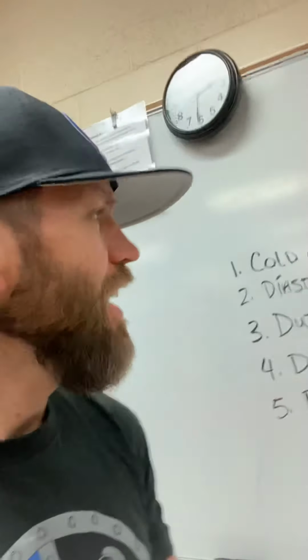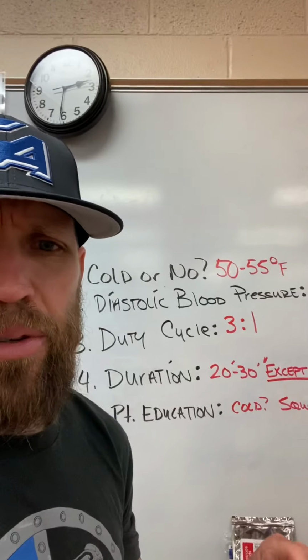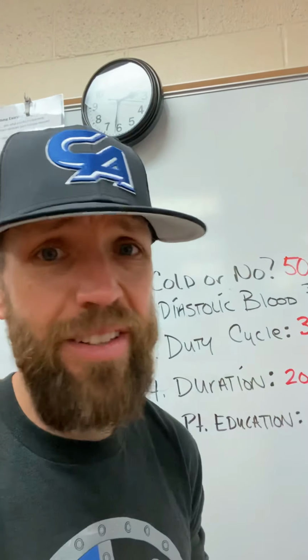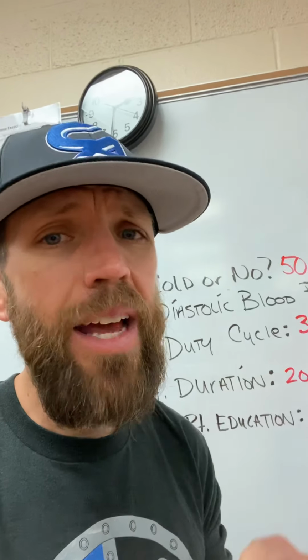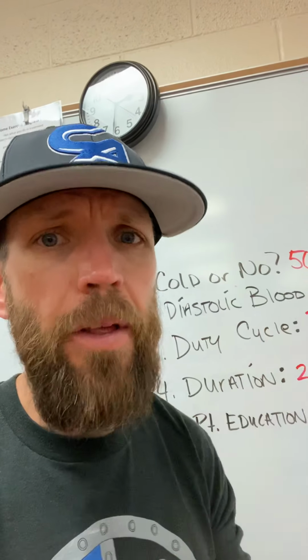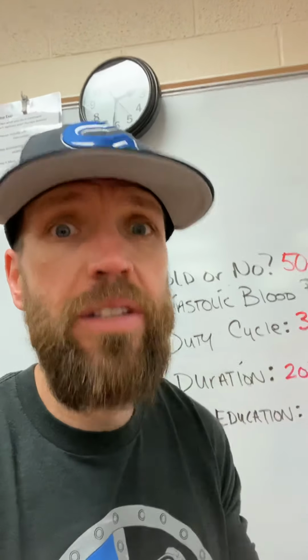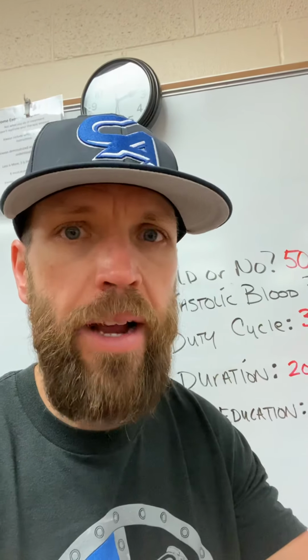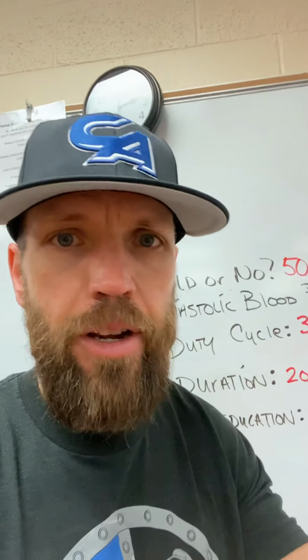But some other things that we need to kind of consider about this treatment, if we're going to use it, is this right here. Are we going to be using cold? If we are, then we need to alert our patient and tell them, hey, listen, this thing's about to get cold. And anytime you introduce compression with cold, you're like magnifying that cold. It's going to get seriously cold then. I mean, it's totally different than laying a cold pack on and just kind of like, ooh, it's chilly.